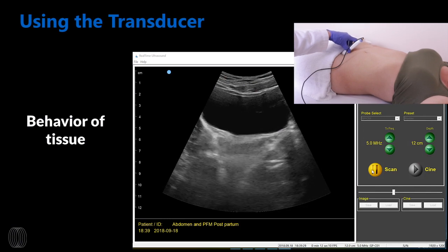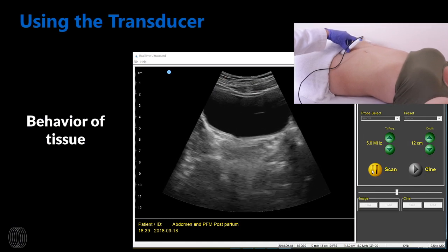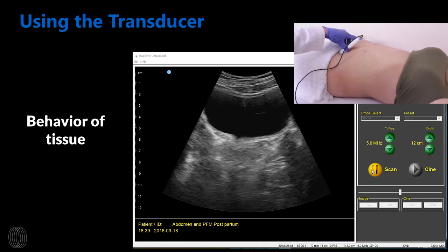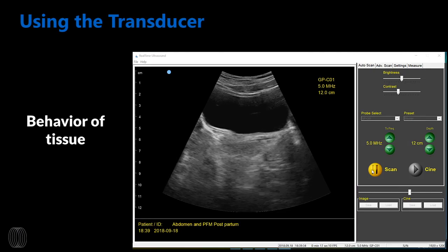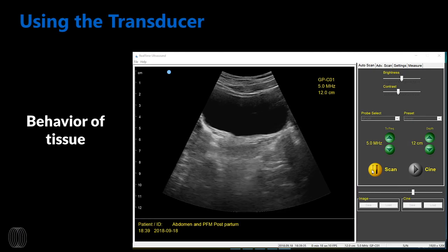The behavior of the tissue is deflection of the bladder base by the midline structures, observed as a cephalad-caudad motion.